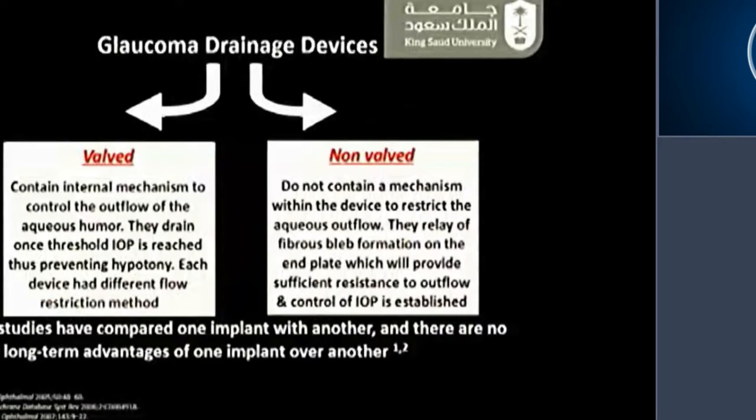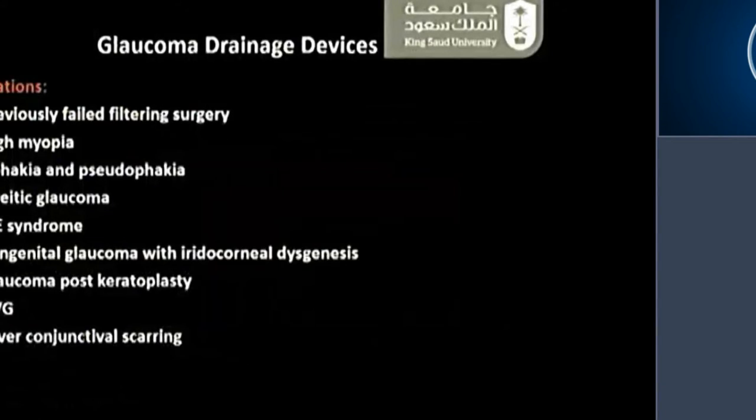While in the valved, you don't need to do so because of the internal mechanism. A few studies have compared one implant with the other, and there are no clear long-term advantages of one implant over the other. The famous one is the Ahmed versus Baerveldt study.